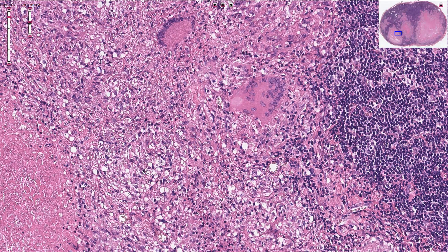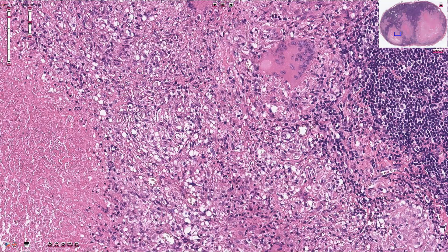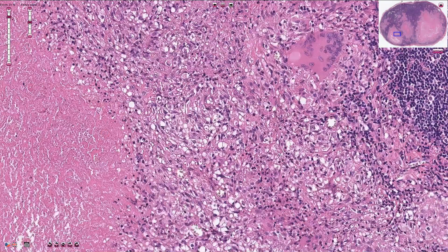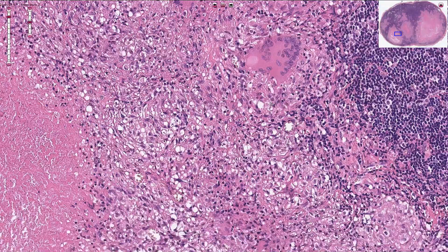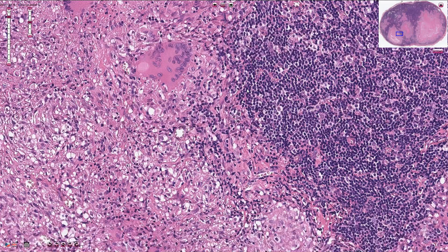Activated macrophages then produce lysosomal enzymes and reactive oxygen species, destroying everything around them — that is why we see caseous necrosis. Interferon gamma is also responsible for the transformation of macrophages into epithelioid cells that we see here, and TH1 cells along with other T cells are also seen here.